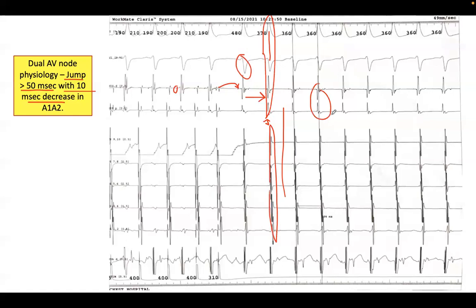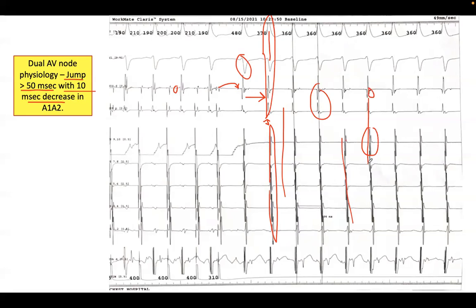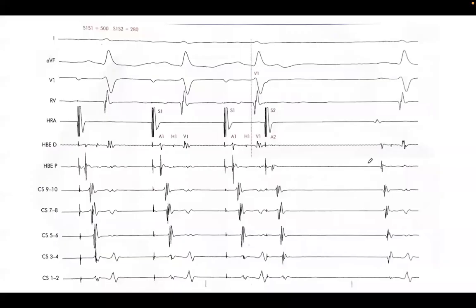This is what we see every day almost in our labs. Proximal atrial activation, proximal to distal. Of course, the CS catheter here is probably your CS 9-10 because this is a pediatric patient. CS 9-10 is probably a little bit in the atria. This is why it looks a little bit latish, because of the smallish CS, but clearly his A is early. Well, very short VA. If it's very short, it's against accessory pathway. And plus the onset is with an AH prolongation, or jumping in this case.